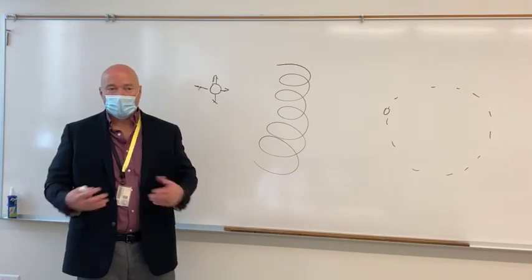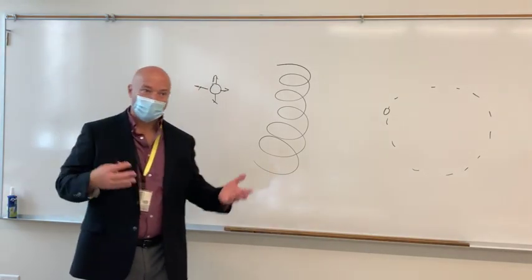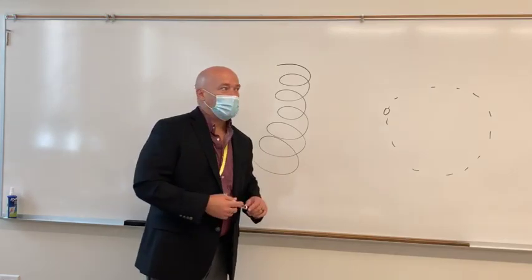And a battery is just a source of electromotive force. So it's electromotive force, being voltage, pushing amperage. So that's the first battery. We don't use that anymore. We use something totally different.